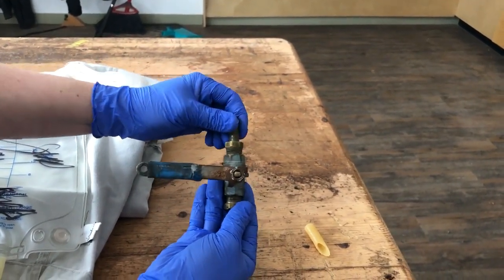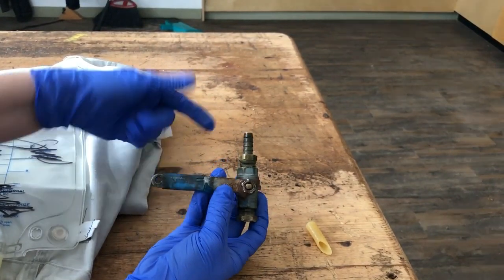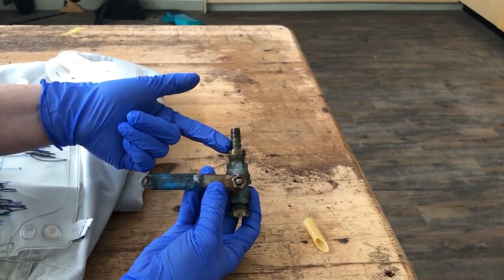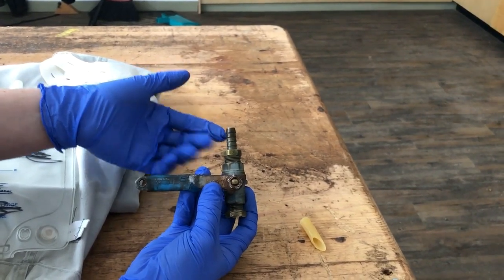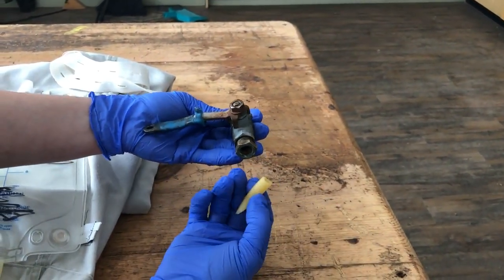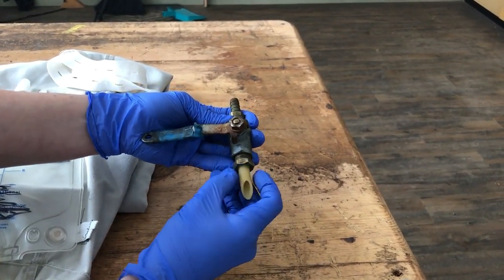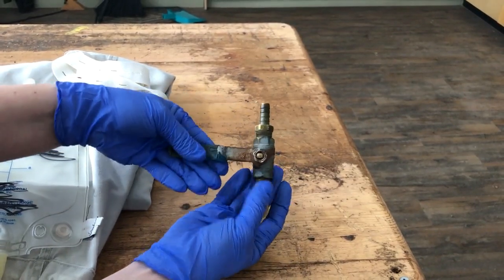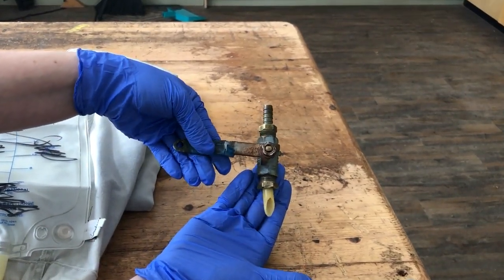And the spigot fitting itself, I've ground down the ridges on it, so it's a little bit easier to get your leg bag hose on and off, in theory. And then on the bottom fitting, jam a piece of surgical hosing in there, and then cut it at a 45-degree angle, and that'll make the pee flow a lot better. And that's all it is.